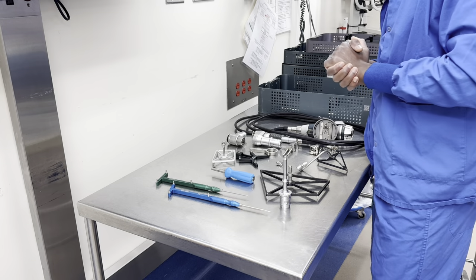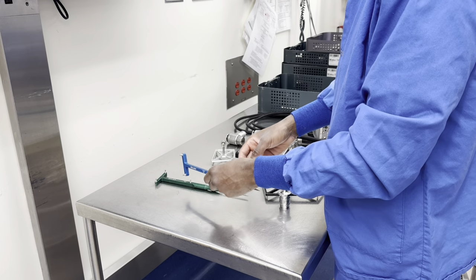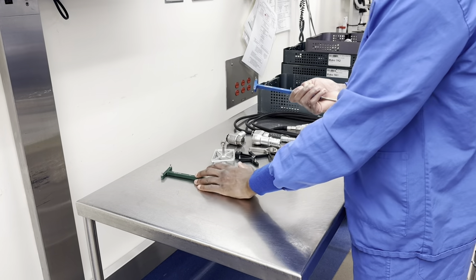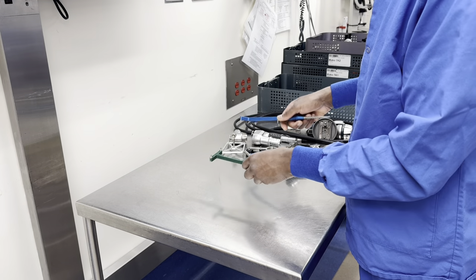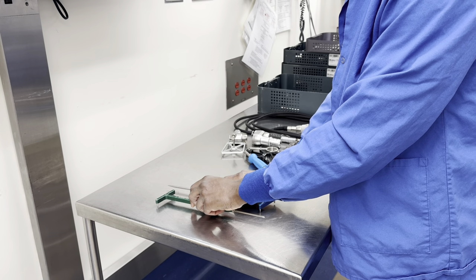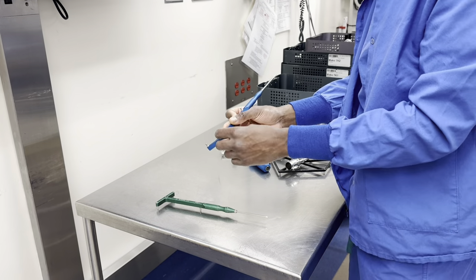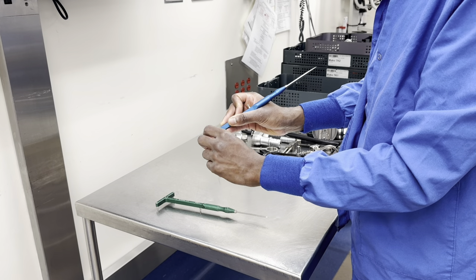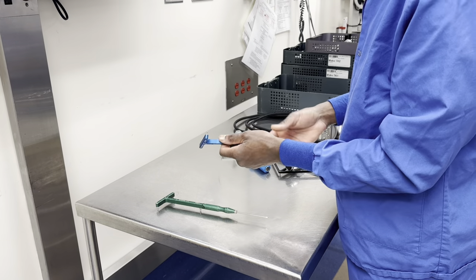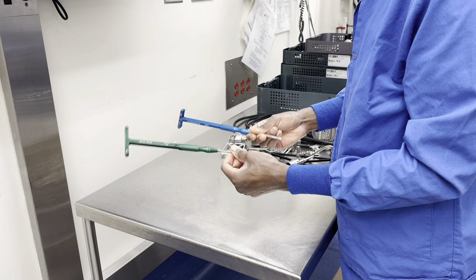When setting up for the Mako Total Knee, you open a pack that has black discs in them. These black discs go on the end of most of the instruments you'll use to register the Mako instruments with the robot. With the Sharp Probe and Blunt Probe, I press the disc on firmly — sometimes hitting the table to make sure it's fully seated. If there's any space between the disc and the probes, it won't register correctly and might cause problems during the case.